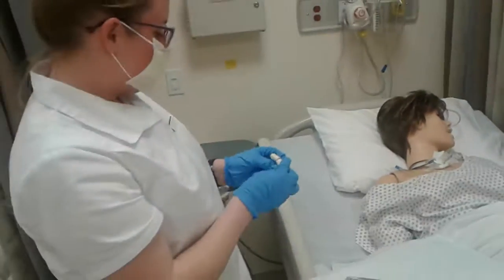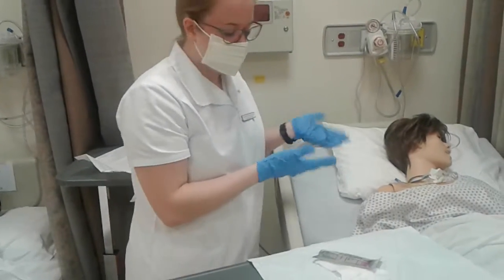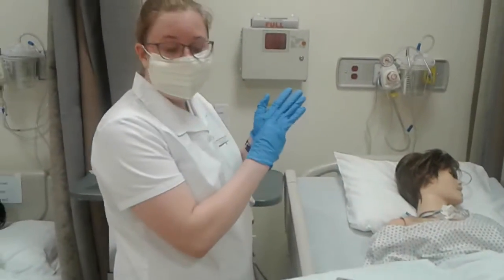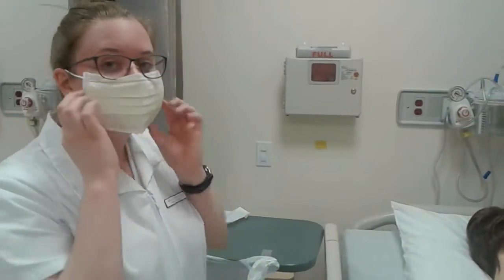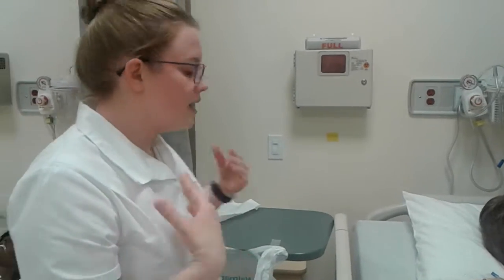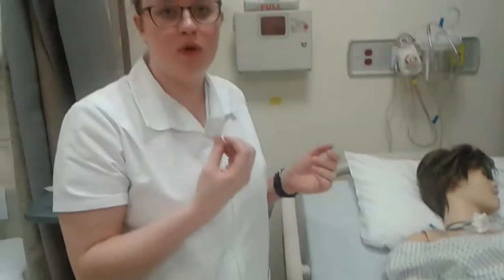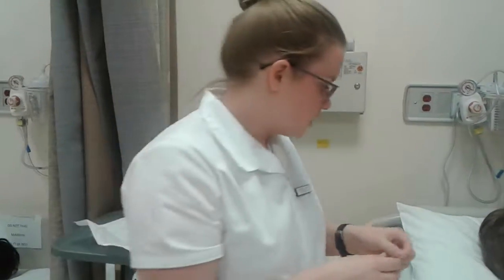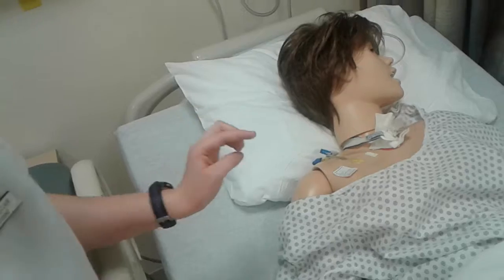Now that my new central line dressing has been placed, I can reassess her comfort status. I'm going to remove my gloves along with my mask. And before I cover her for privacy, I do need to place my label on the new central line dressing, specifying my name, the date, the time, and when it's due to be changed next. And I'm going to place this on the side, but not directly over the central line.